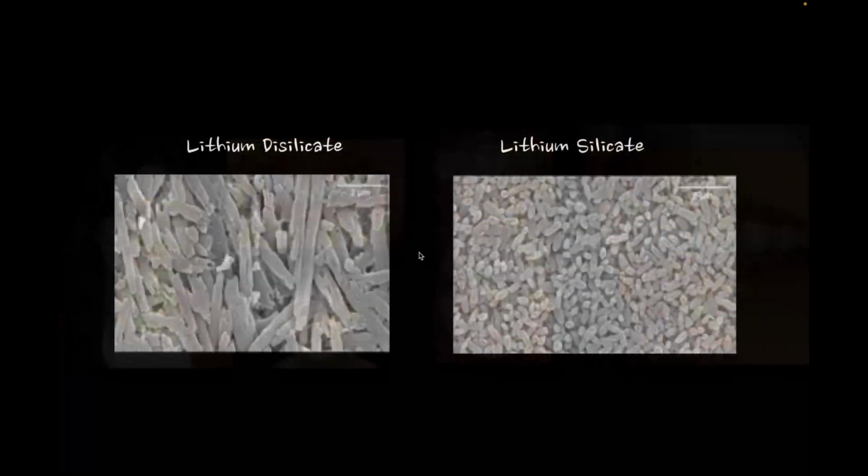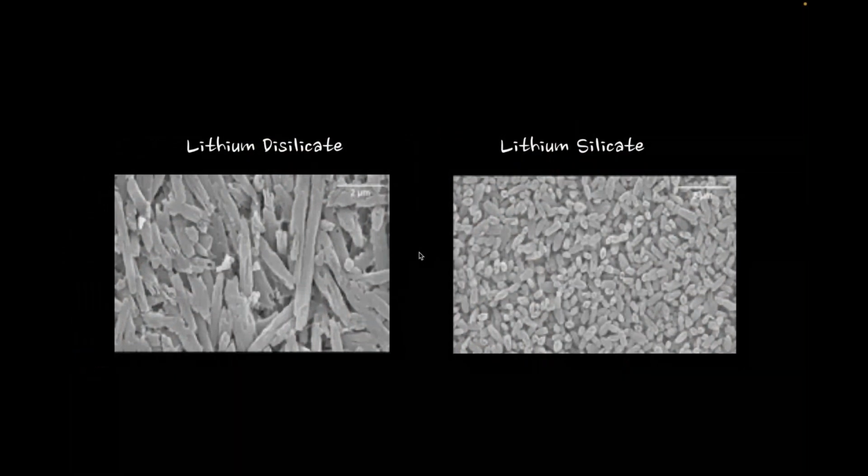When we get into the silicates and disilicates, I showed you that chart of all the different materials. What's interesting is, out of all those materials, lithium silicate and disilicate is probably the most used material across the board in dentistry today. I'm not sure if that's good or bad. I don't really know the right way to say it. I will just tell you that most of us already know that we're in lithium disilicate world. One of the challenges we face is value. It's always a struggle for us to maintain the values that we need, especially in that high-end aesthetic type case.